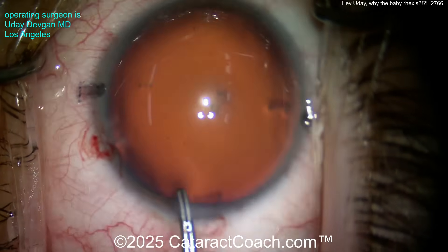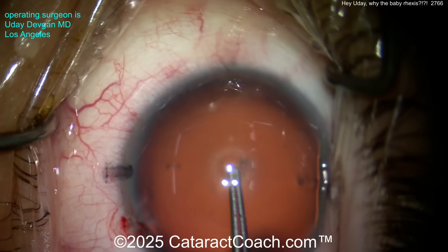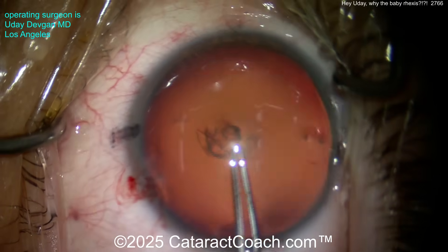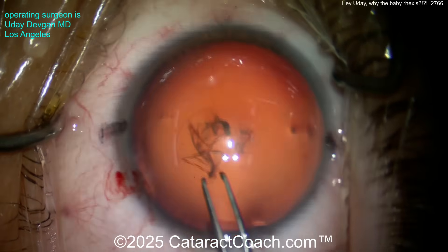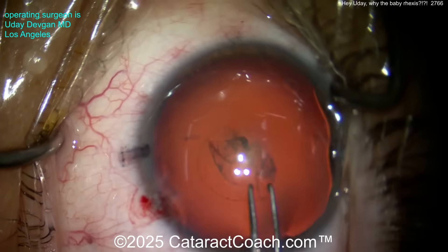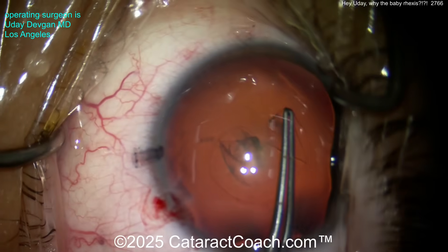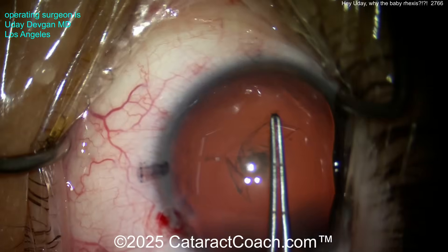So this is a large myopic eye. Now look — I'm using the forceps to measure: what's the center, what's the diameter, what's the radius. I'm measuring again and again because it's such a big eye — I need to make sure I'm making the correct size rhexis. You think it looks too small? No, I promise we're measuring it right. Finishing that rhexis, going around nice and easy.